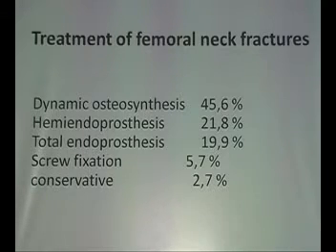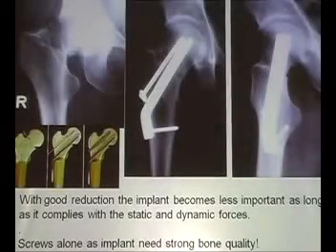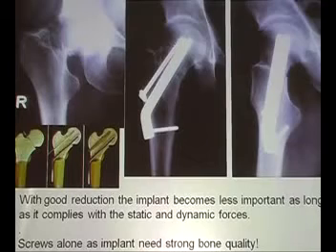Maybe good or maybe bad, I don't know, because also with these implants, with these arthroplasties, we get a series of major complications. What has become clear over the period of time is that reduction is utmost important. That was said by Pauwels very clearly. Reduction and a careful reduction. You should not turn around the head once or twice in rotation. A careful reduction. And for a careful reduction, I still feel the operation on a normal table is more careful than on a traction table.